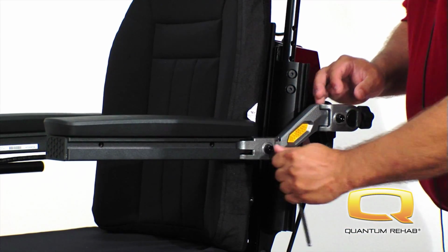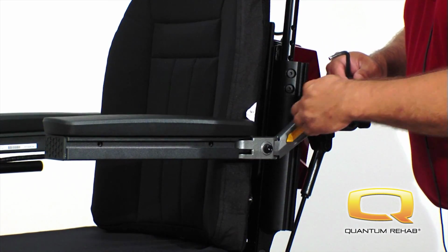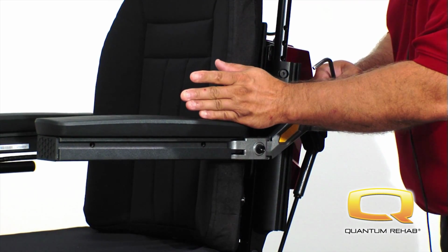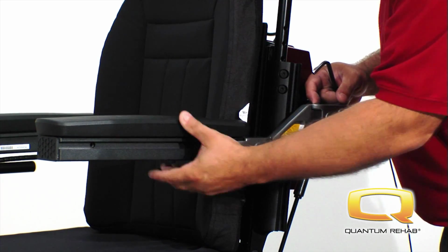I want to note that there are two things that are important about this. One, from the factory, these arms will be set in the straight position. They are not custom tailored to your patient. Item number 2 is this.